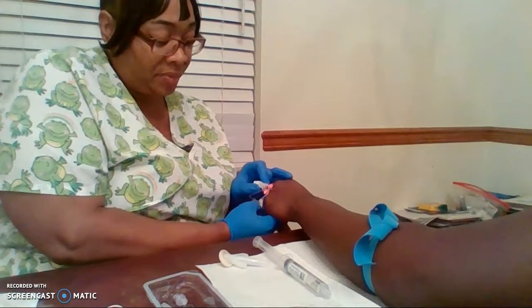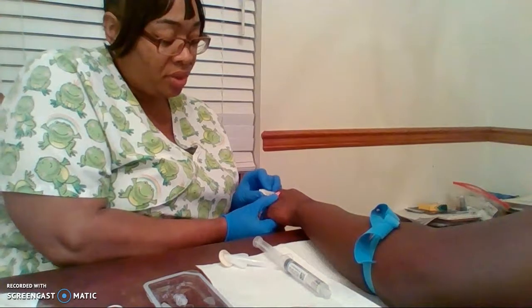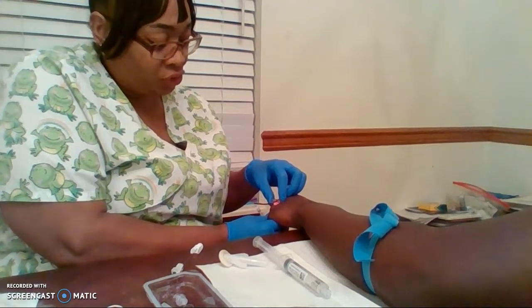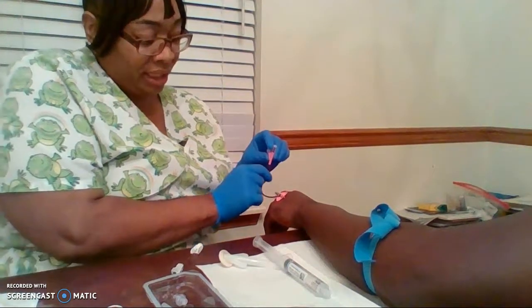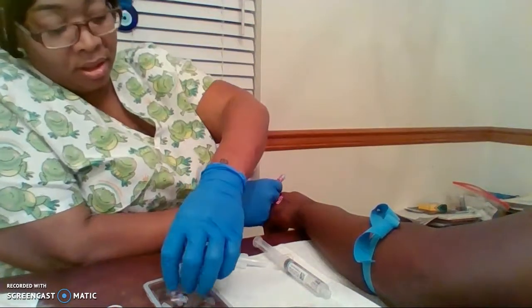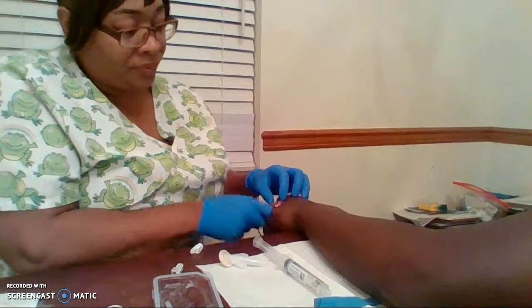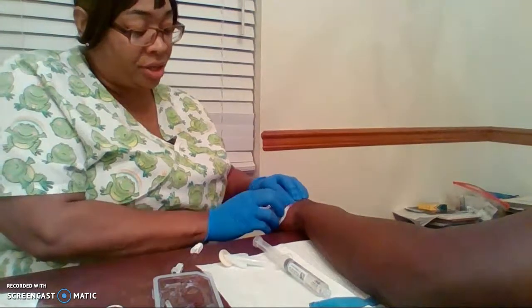The blood is filling up here in that chamber. You'll hold on to the pink part and pull back on the white. And you should get a good fill up into this chamber here. You're going to clamp it, secure the tips, place a catheter there. You could place a vacutainer there to draw blood. Cover it with a Tegaderm.